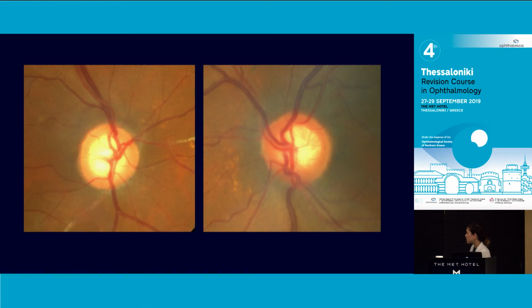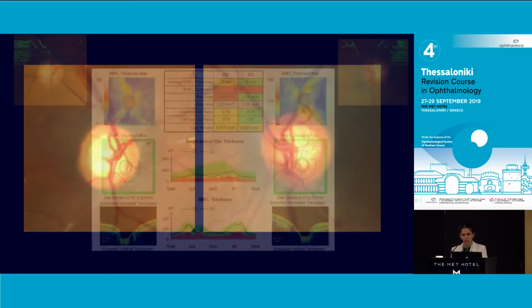So at least just by looking at the nerve, it doesn't look to me like a glaucomatous nerve. Of course, it's a 2-dimensional image, but still, the left eye probably seems to be okay. So the label of POAG suspect probably makes sense here.